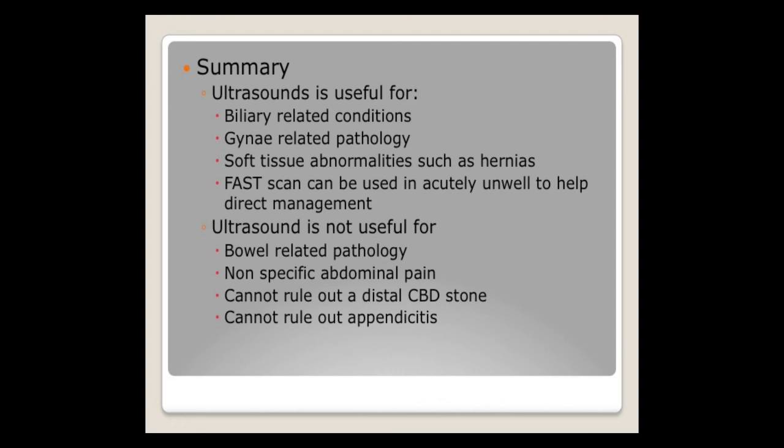Ultrasound scanning is not so useful for patients presenting with bowel-related pathology such as bowel obstruction or tumours, and is not useful in the assessment of non-specific abdominal pain. It's important to remember that ultrasound scanning cannot rule out a distal CBD stone in the presence of CBD dilatation, and is not able to rule out appendicitis. Ultrasound scanning should never be used as a diagnostic test for patients presenting with suspected appendicitis.